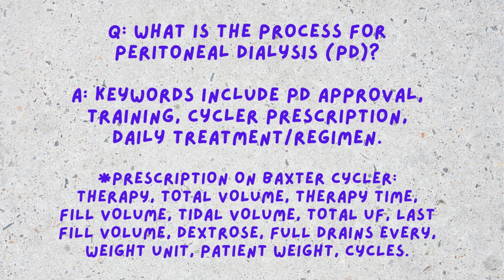Depending on the company's rules, some companies deliver your inventory once in 2 weeks or once a month. So you will have a significant amount of inventory in your home if you are receiving delivery once a month. Delivery inventory will include the dialysis fluid, cassettes, probably patient extensions that would help you move around your home. That would be like maybe 6 feet or more.